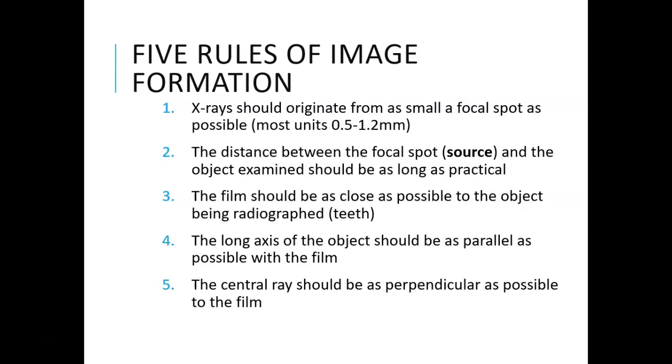So the film should be as close as possible to the object being radiographed. We want to put our sensor as close as we possibly can to the teeth. The long axis of the object should be as parallel as possible with the film. We know this from our paralleling technique. And the central ray should be as perpendicular as possible to the film. This is going to give you the truest representation of the tooth if these rules are adhered to.